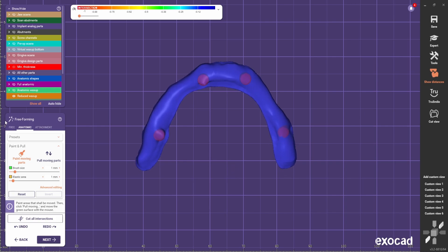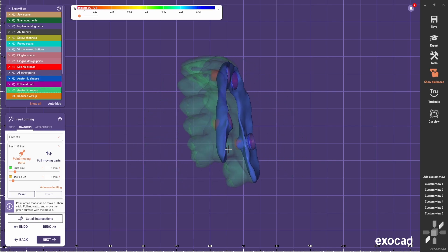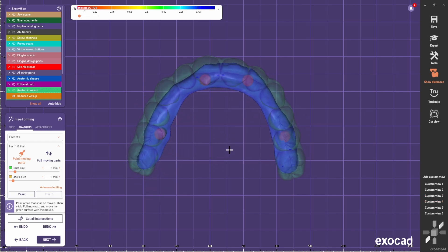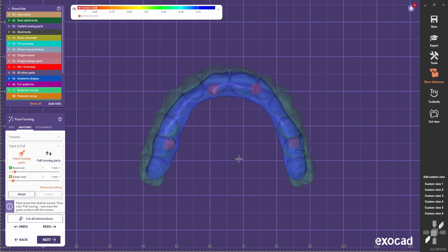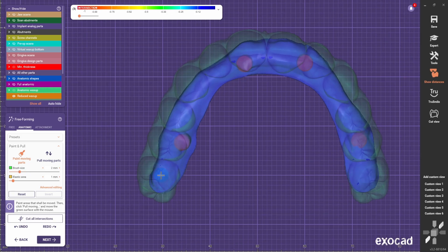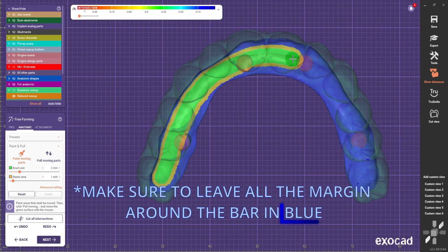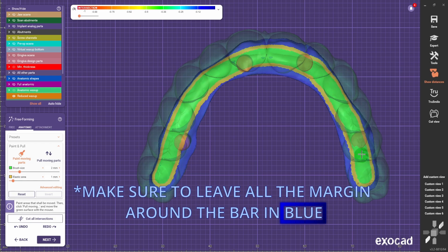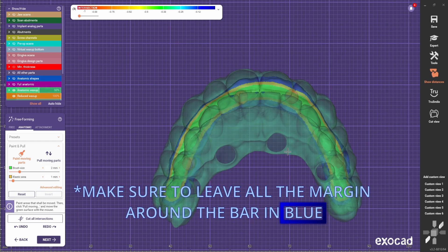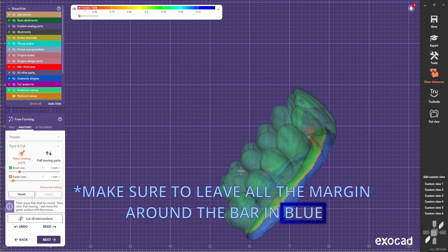We come to the paint and pull part, and we're going to create the height of the bar, because right now it's very short. We're going to use this anatomic wax-up as a visualization tool to see where to paint and where we should pull later on. Basically we're going to use this tool to create the body of the bar — for that we're going to paint, like this. Always use this as a reference to know how much we can bring it up.